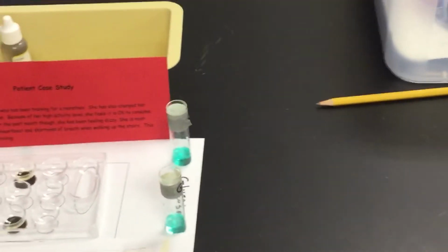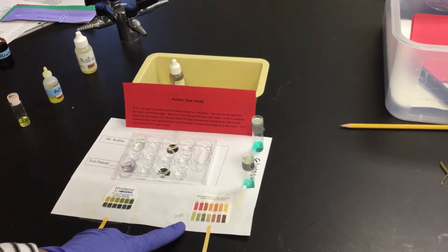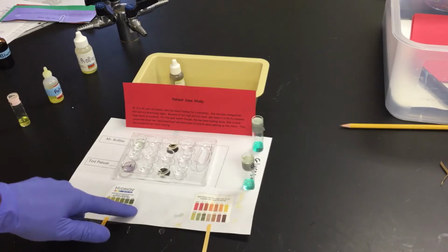Next part is pH, and with the pH, there are two scales down the bottom there. The first scale over here goes 0 to 14. It doesn't give you a really exact number. You can go half numbers on it. The second scale is a little bit more detailed, so it measures every 0.2 to 0.3, and it's going to give you a better idea. The range that we have here is from 5.5 all the way up to 8.